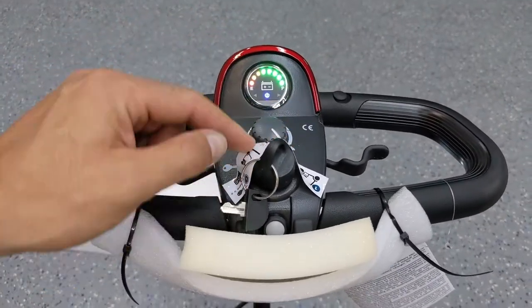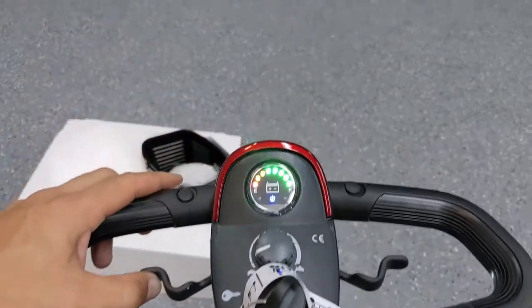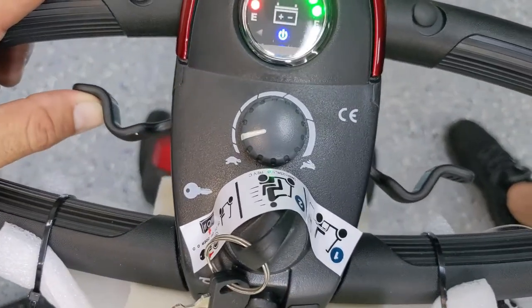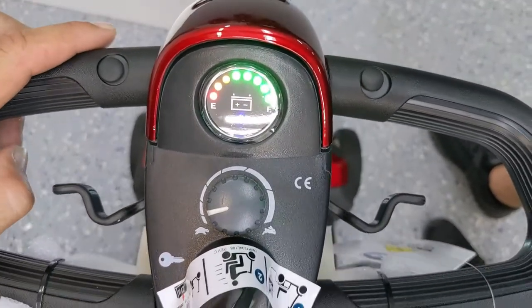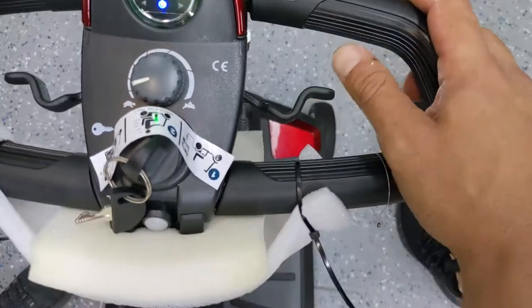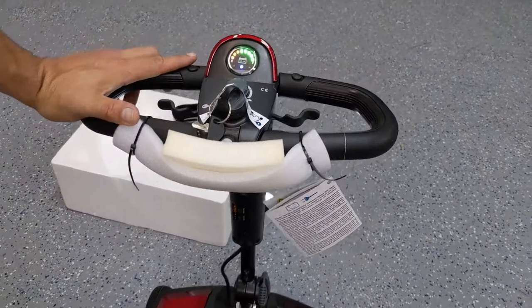It's in the fastest speed setting right now. I'm going to slow it down by turning that knob all the way to the left and demonstrate that you can operate this scooter with one hand, either left or right. Right now I'm using my left thumb — if I push forward, it goes forward; if I pull back, it goes backwards. I could do the same thing with my right thumb. This is a delta tiller made for ambidextrous use.